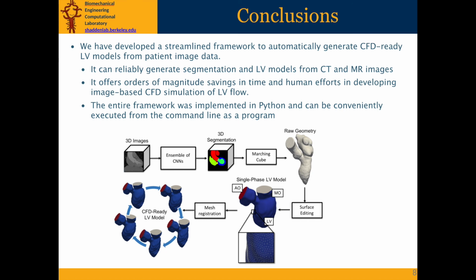The entire framework can be conveniently executed from the command line as a program with all the dependencies being open source. The above advantages may enable our framework to aid in future higher throughput, large cohort analysis of patient-specific LV hemodynamics in relation to LV dysfunction.